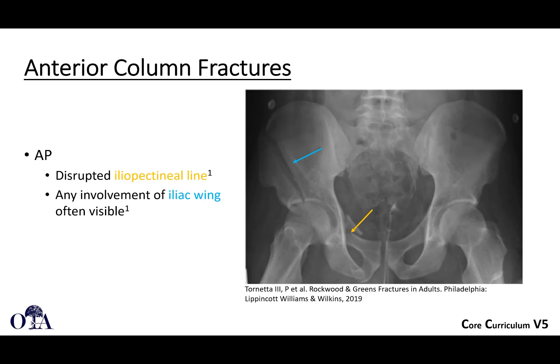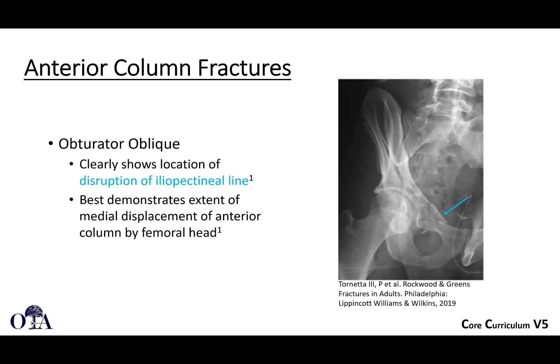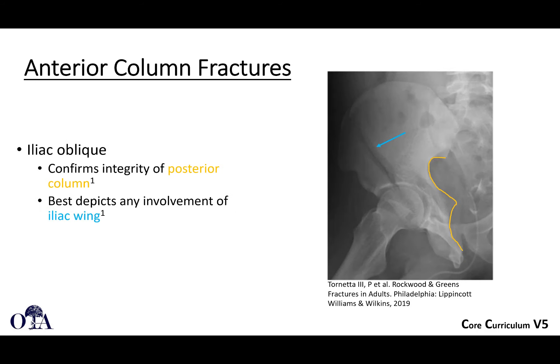On the AP, you're going to see a disrupted iliopectineal line. You can see a nice intact iliopectineal line for comparison and disruption at the fracture site. The iliac wing fracture, if you have the high type of anterior column variant, you're going to see an iliac wing fracture on the AP view. On the obturator oblique, you should very clearly see disruption of that iliopectineal line and anterior column disruption, and any medial femoral head displacement. On the iliac oblique view, you should be able to confirm that the posterior column is intact, and the iliac wing fracture will probably be seen a little better.